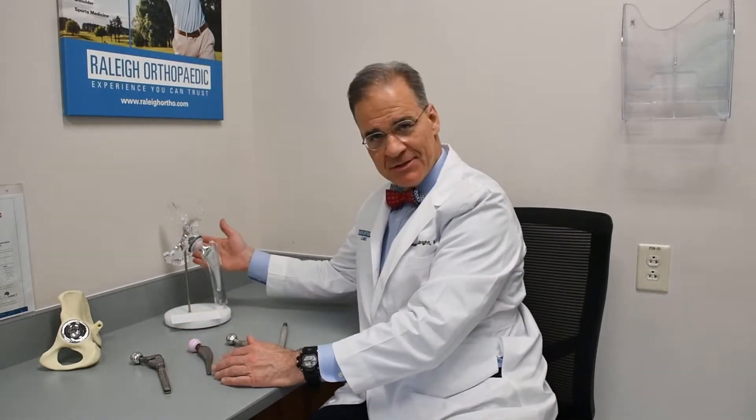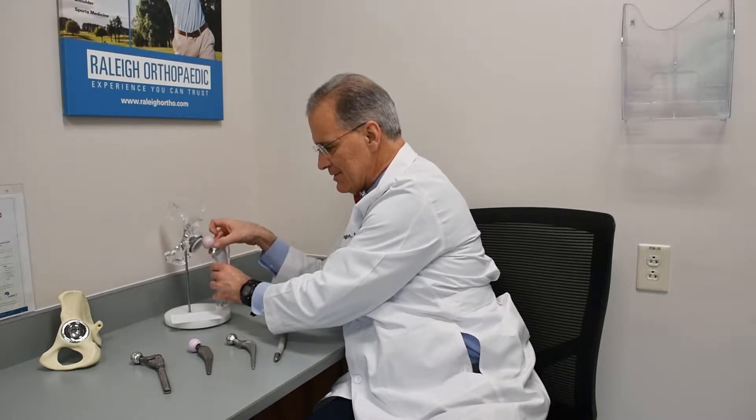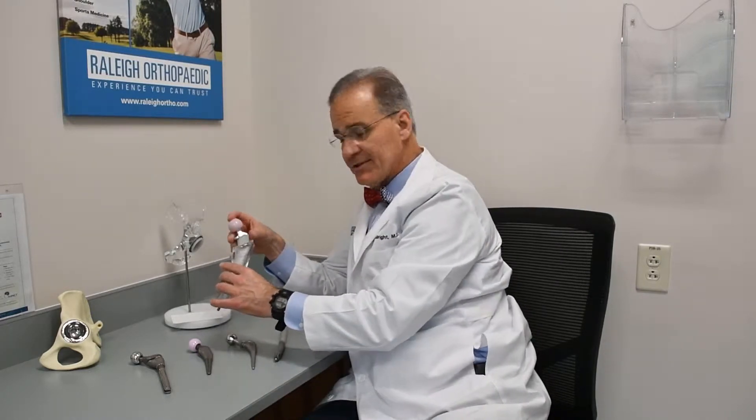And it's a good question. This is a hip replacement model here. The first part we focus on is the stem — this is the spike that goes in the middle of your bone. Your bone is a cylinder, and we put a stem in there.